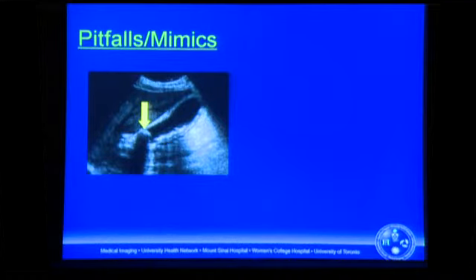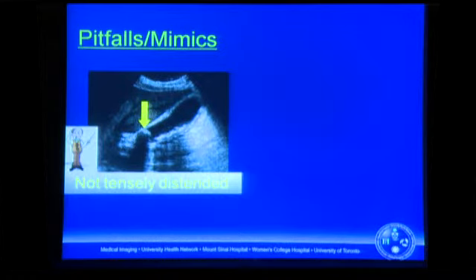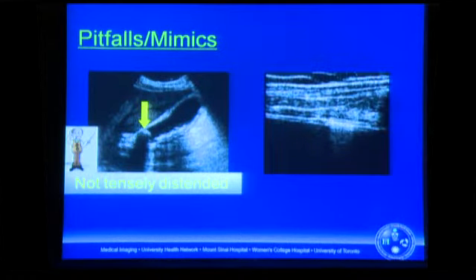But I want to draw your attention to this anterior wall. And instead of bulging outward, as you might expect in a truly distended gallbladder, it's convex towards the lumen. So that caused us to pause and say, well, this isn't a tensely distended gallbladder. I don't see evidence of perforation or a pericholecystic abscess. We best take a closer look. And when we went into the room, we realized that this patient had a much more generalized peritonitis.